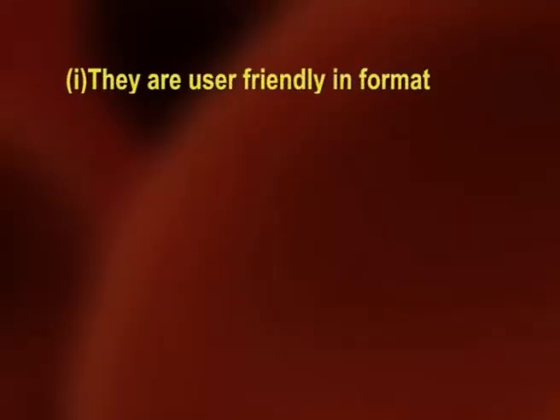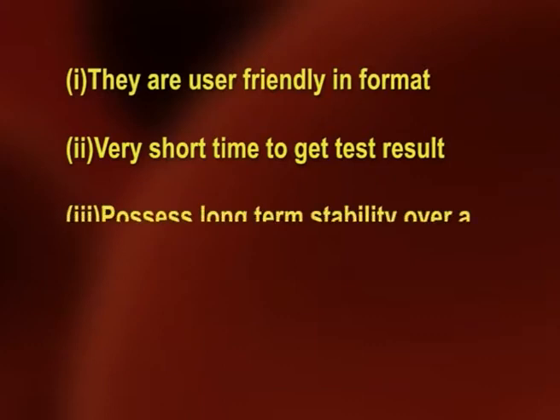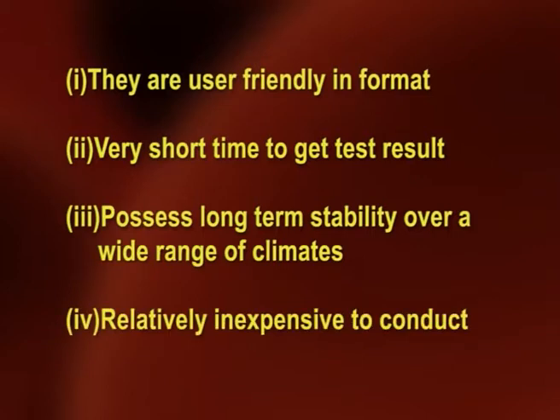The benefits of an immunochromatographic test include: first, they are user-friendly in format. Second, they take a very short time to get the test result. Third, they possess long-term stability over a wide range of climates. And fourth, they are relatively inexpensive to conduct.